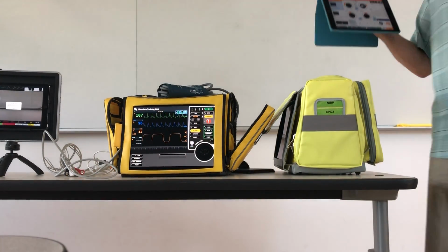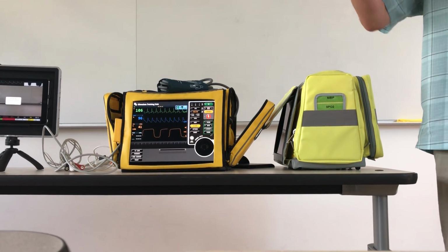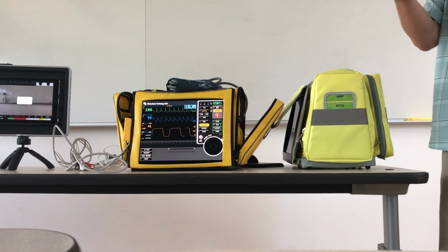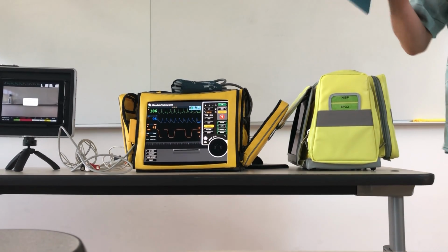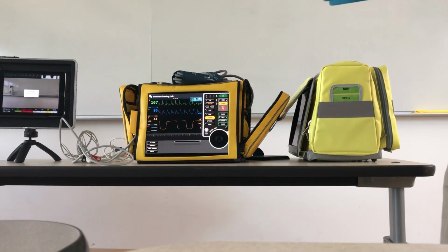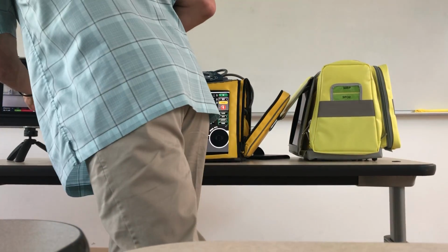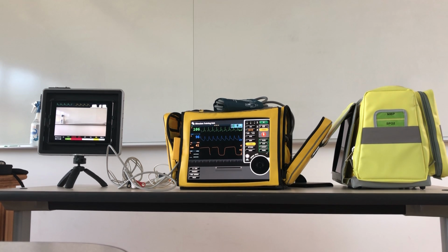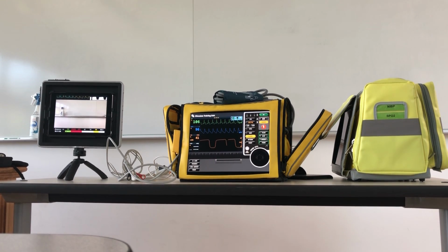With the Zoll on the monitor, it doesn't have a way for you to pop up and pause and look at a printed copy, but you've got the 12 leads continuously that you can watch while you're doing whatever. So it's kind of a trade-off there, similar to using it. But I'm sure they're working on that. The other option is low disk space. Lovely. So with any of the 12 leads, you have that capability.